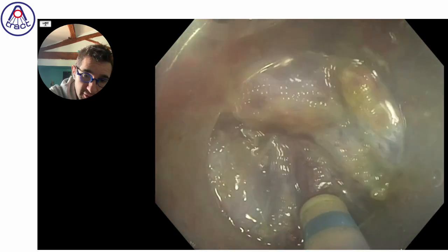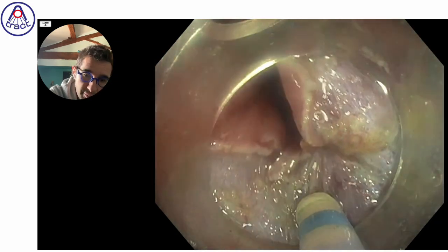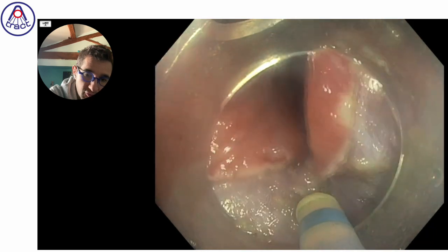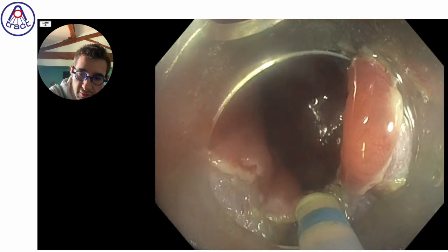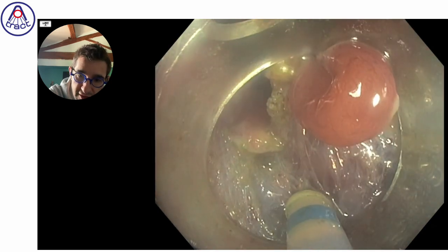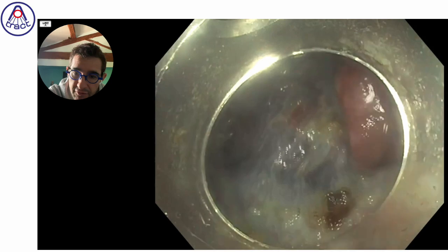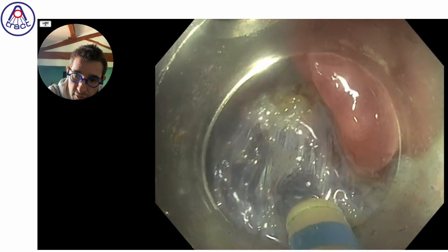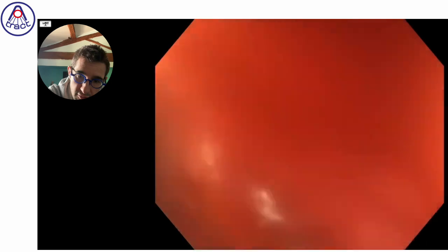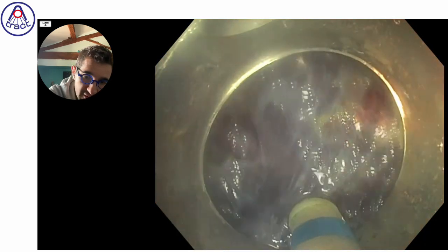It could be helpful because the traction could be better, but the time we will lose by changing for a forceps to increase again will not be saved by a long procedure. So in this case, while the exposure is still very good, I think we will be able to go on the edge and cut the complete lesion without tightening the device.